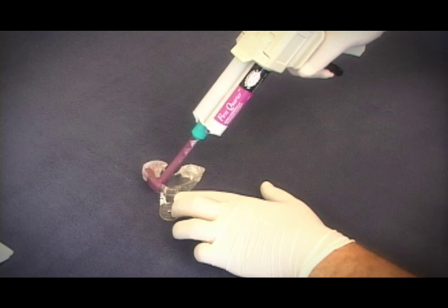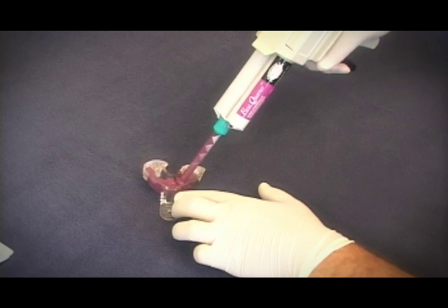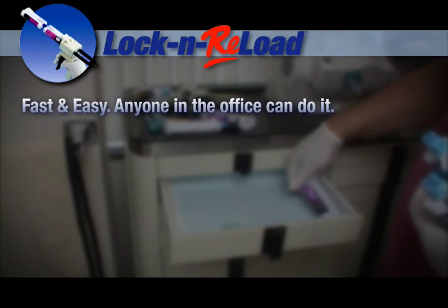After attaching the mixing tip to the refilled cartridge, the process is the same as always. Just load your tray and you're ready to go. Fast and easy — anyone in the office can do it.